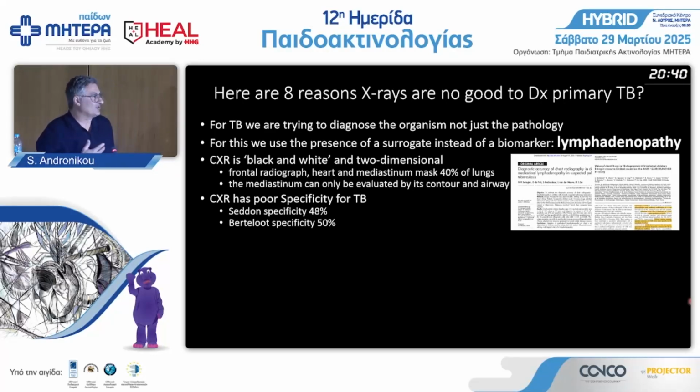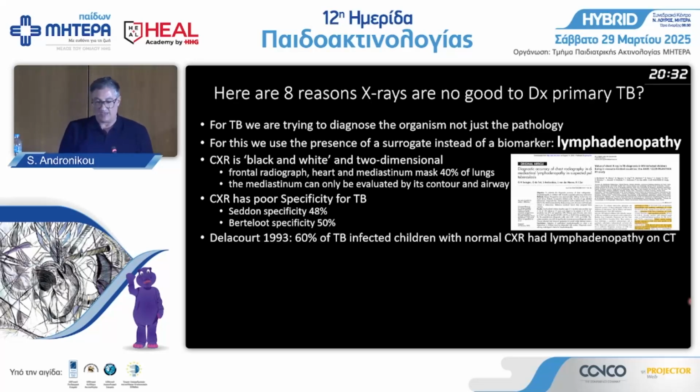To me, this is a useless test. If you cannot tell the patient you do not have TB, go home. As opposed to, you really don't have TB, go home. So the other bad thing is when they do CT scans, and a lot of people don't do that, and that's the problem with the AI tools. Everyone is annotating AI tools on the X-ray, not with a CT backup.